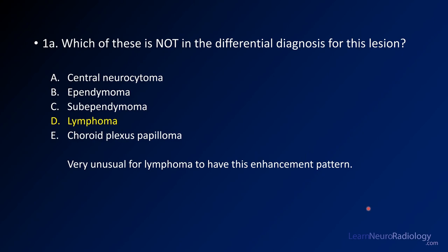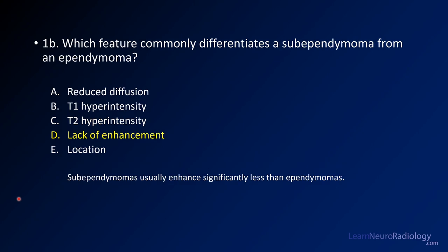For question one, this is definitely not a lymphoma — lymphoma doesn't have this enhancement pattern, it's much more solid appearing, and the location isn't right. Differentiating lymphoma from central neurocytoma is something the ABR examinations definitely want you to be able to do. For question two, what differentiates a sub-ependymoma from an ependymoma is that lack of enhancement — sub-ependymomas enhance significantly less. If you see a non-enhancing ventricular mass along the ependyma, think sub-ependymoma.